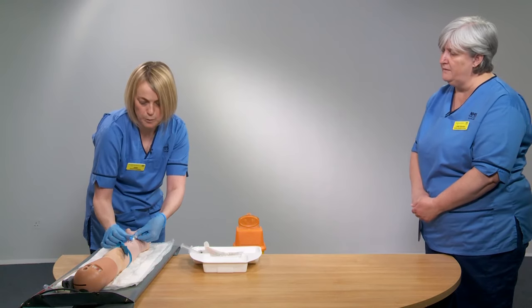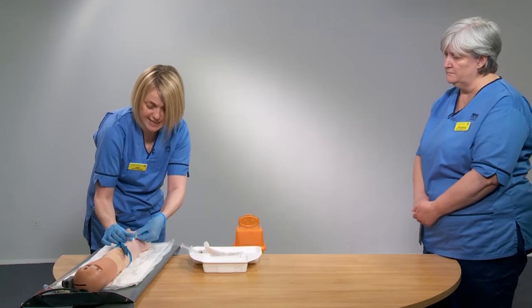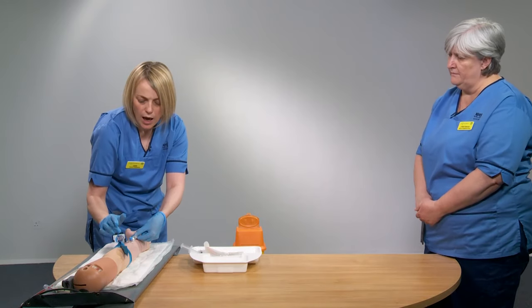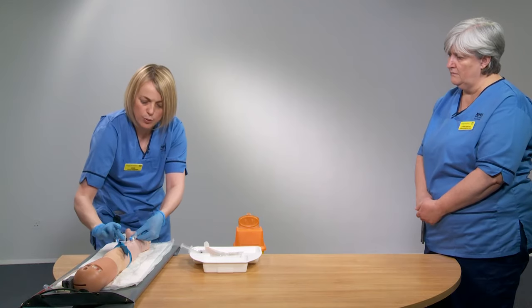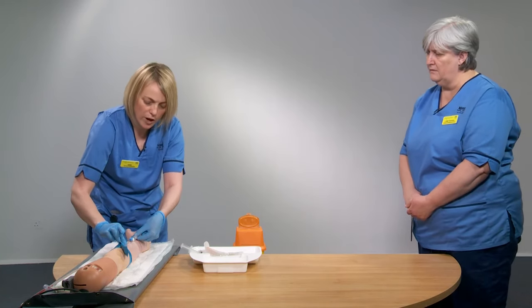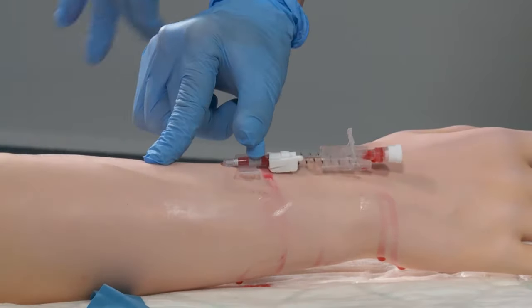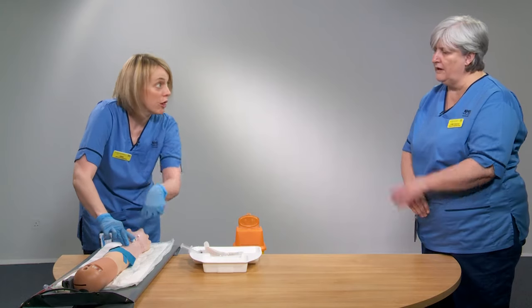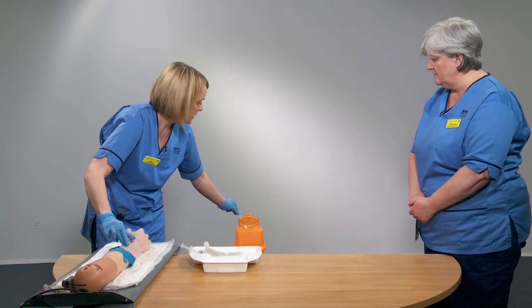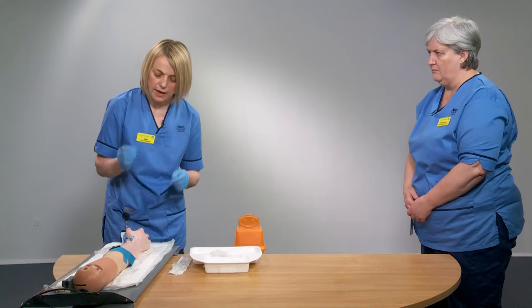It's really important that you stabilise the needle where it is, because if you push it any further you might go through the back of the vessel. Now that my cannula is fully advanced and I have my second flashback, I'm ready to take the needle out and attach my needle-free access device. To reduce the risk of backflow of blood, put one finger above the cannula to occlude the vessel temporarily, one finger on the cannula to secure it, then take your tourniquet off and take your needle out. Pop that in the sharps bin — you can see the safety device is automatically activated, with the tip of the needle covered.